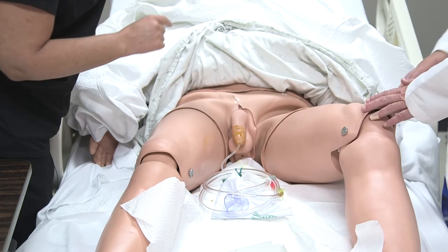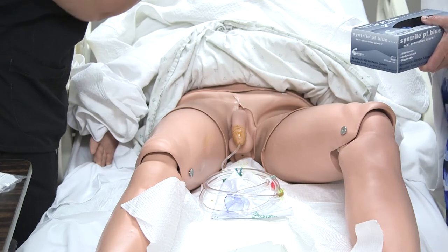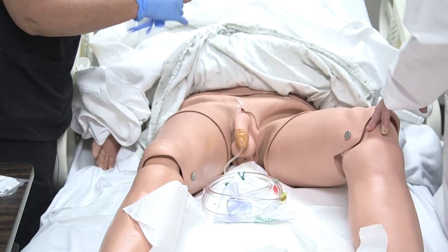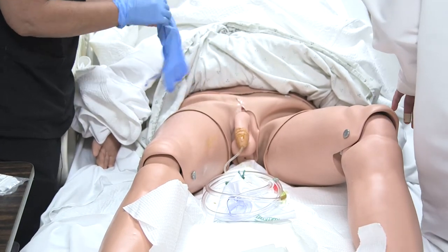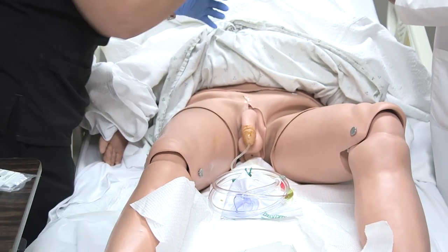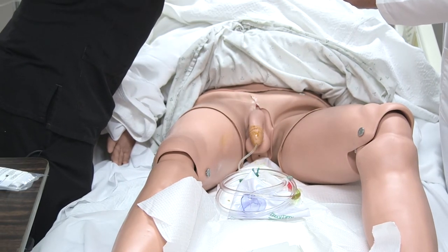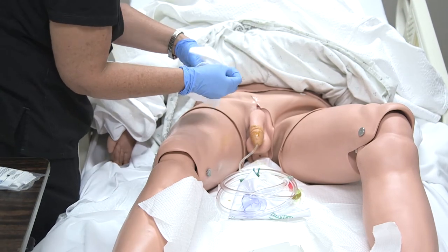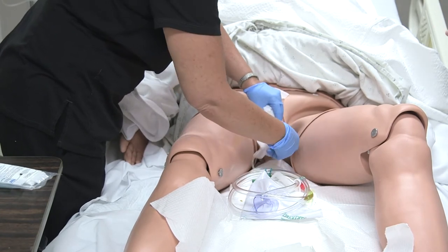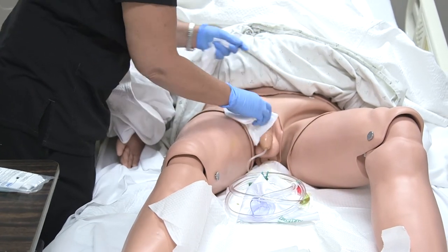Kim, could you please hand me a couple pair of gloves there? Thank you. All right, so we're just going to get you cleaned up here. We might have some peri pads, or our peri cleanse. We'll get you all cleaned up, because that betadine kind of likes to stay on there a little bit. Sorry, this is a little cold, but I'm just going to clean this off here.